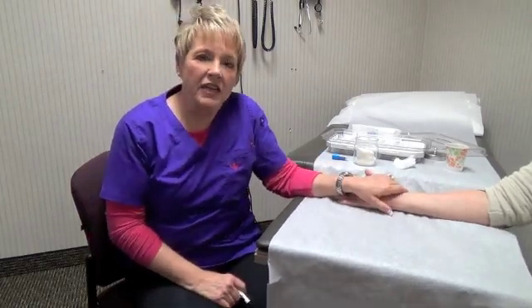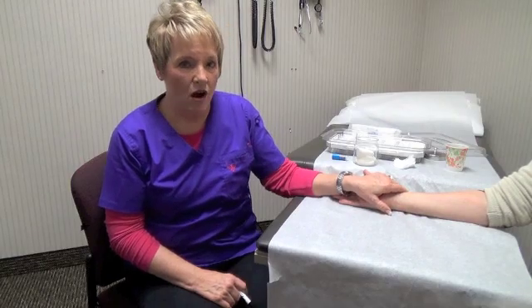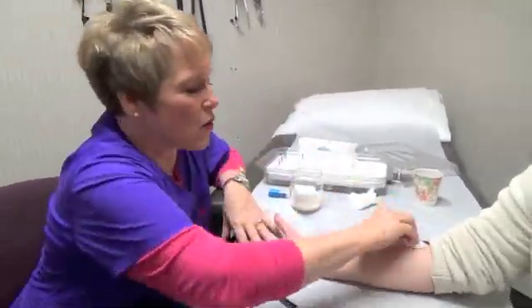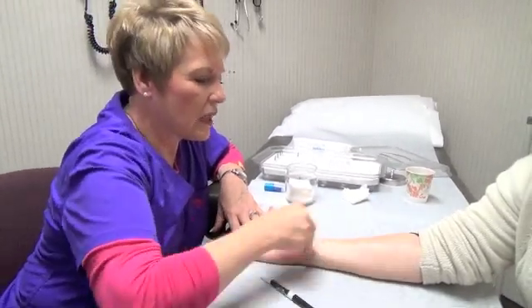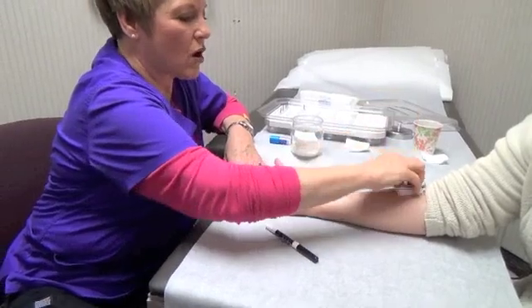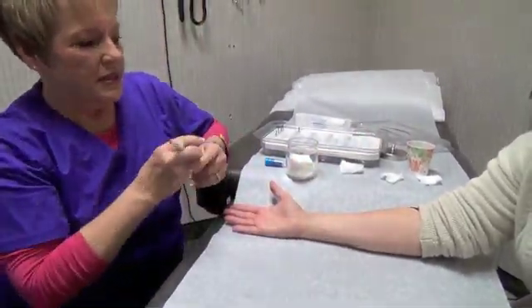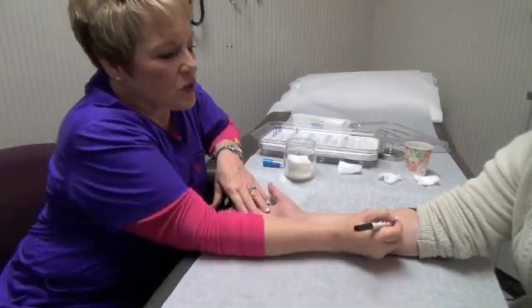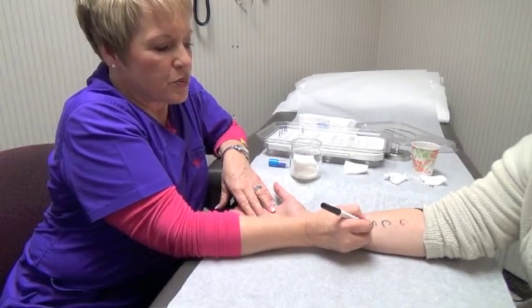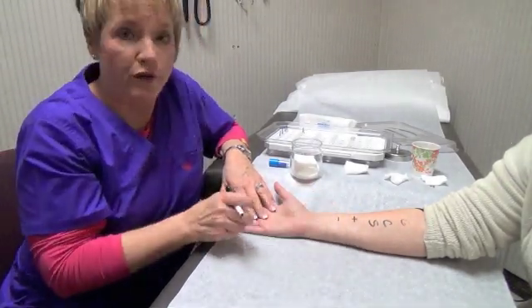Typically if we're doing a full panel of tests we use the back, but for demonstration purposes we're going to use the arm. First we cleanse the test site with alcohol, then we wipe away any excess liquid with gauze. Then we label for the testing that we're going to do — in this case we'll test for grass, cat, sagebrush. We also do a positive and a negative control for comparison.